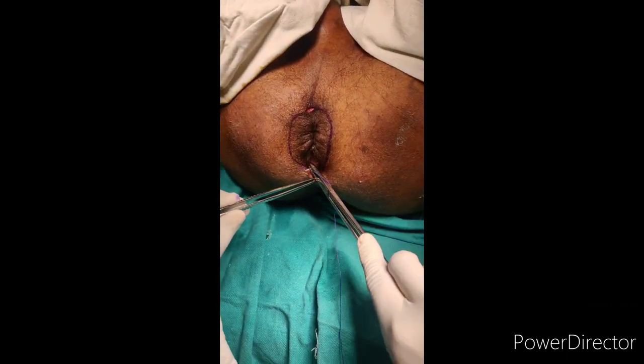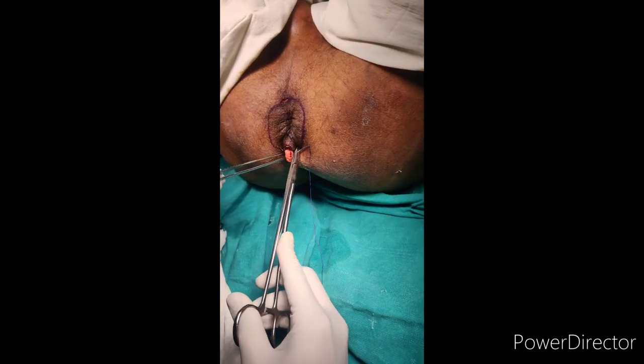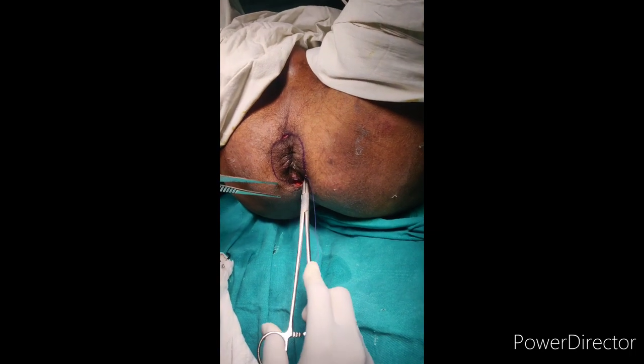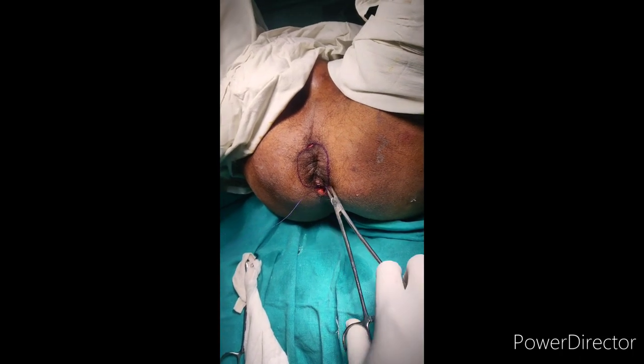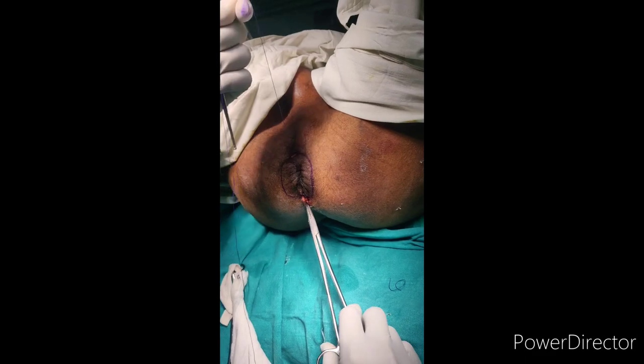Burying of the knot is done with Vicryl 2-0. Then we close the entry point, and the same stitch is continued at the exit point, and the procedure is completed.